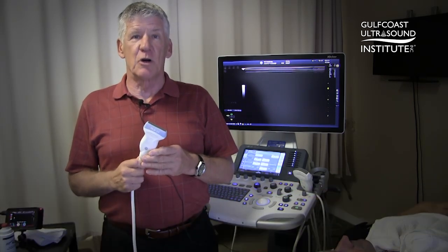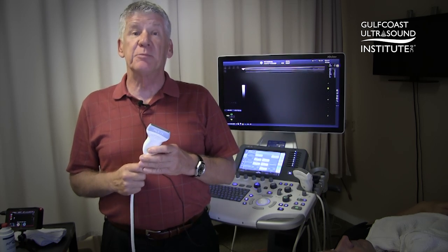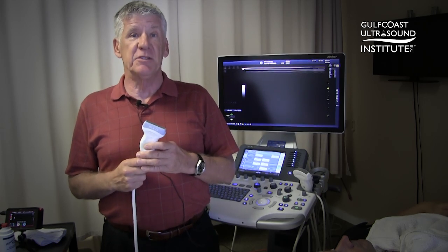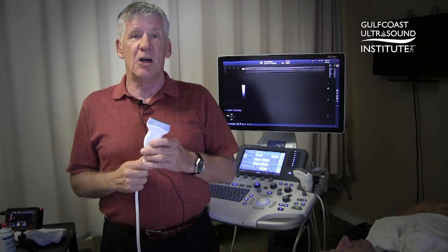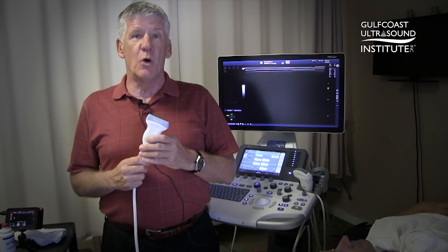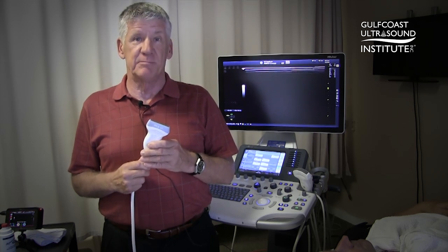Hi, this is Rob Daigle. Our technical tip for today is how to differentiate the internal carotid artery from the external carotid artery based primarily on anatomy. The position of the internal carotid artery in the neck can help us differentiate these two so we know what artery we're on even before we turn on the Doppler.